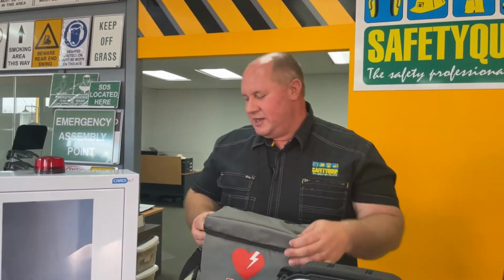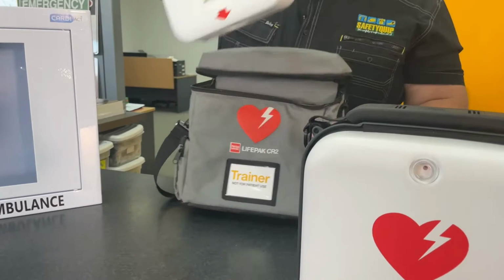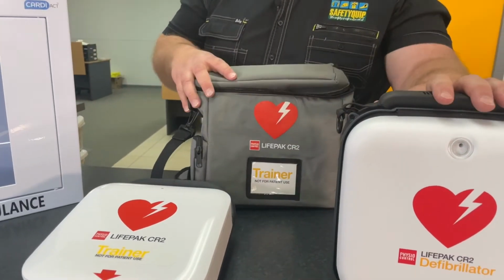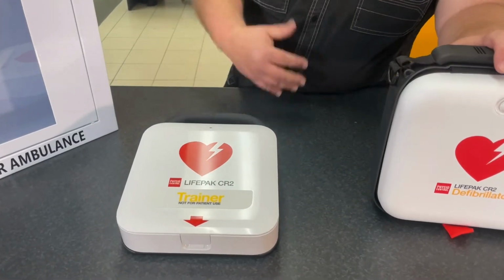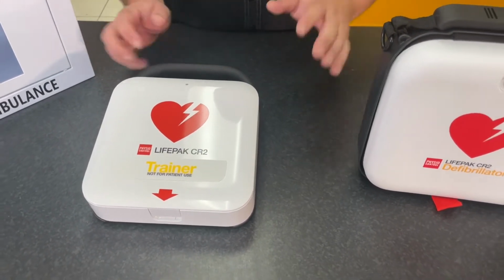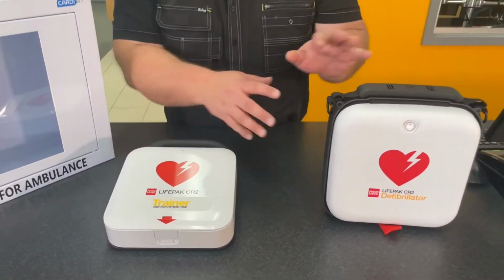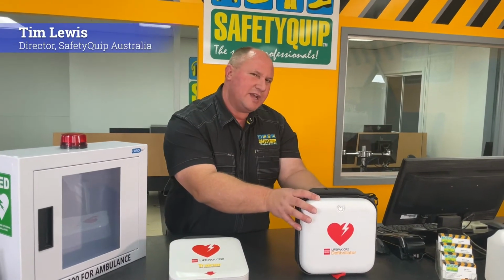Now I've grabbed one of our training units. Now this is the unit that we would typically bring out to a client's site when a defibrillator has been purchased for a client's site, and people are needing to be shown that it exists and how to use that defibrillator and when to use it specifically. Now it looks the same as what's in this soft case, so we would normally supply a new unit in a soft case like this.